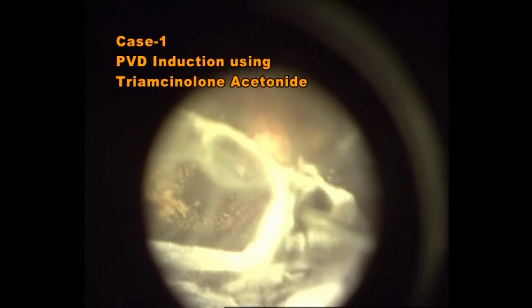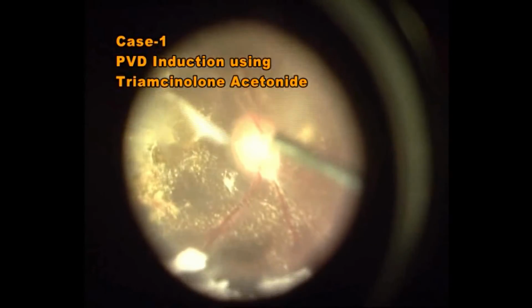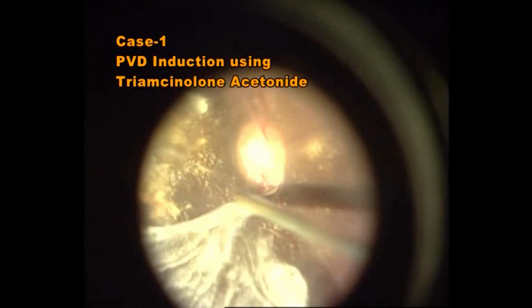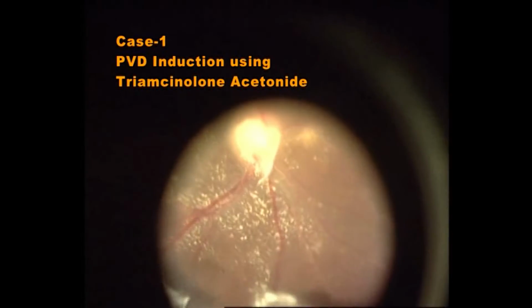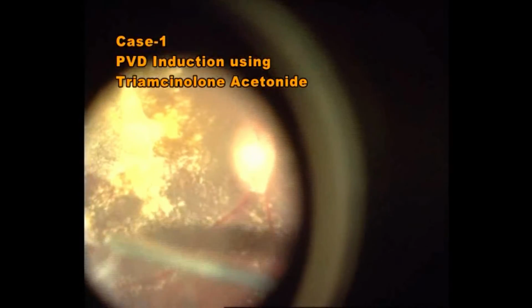A few residual crystals of triamcinolone acetonide which will be left behind at the end of the procedure will contribute to reducing the postoperative inflammation and resolution of the spongy and cystoid macular edema as well as the subfoveal serous detachments which are present in this patient. In this patient, the same technique of PVD induction is used.